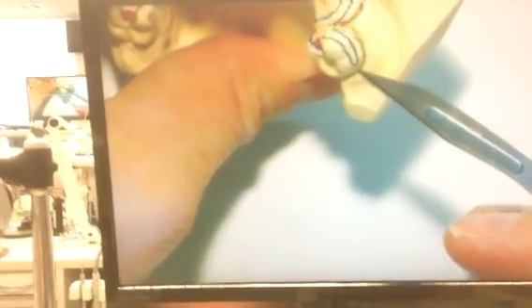Mandibular molars, because they have the natural tilt towards the lingual, oftentimes you'll find your better undercut on the lingual than you will on the buccal. That doesn't let you out of having a reciprocating arm. If you have retention here, which in this case they did, there's your red retentive mark, then we have to have something to reciprocate it on this side, in which case they used a circumferential clasp that's above the height of contour. The height of contour mark is far down here. So as long as you keep that above the height of contour, it's going to provide your reciprocation.